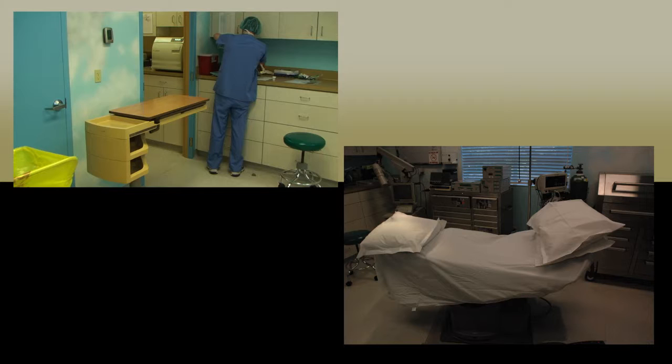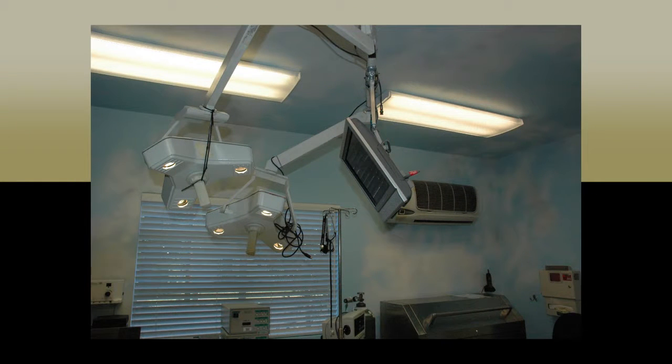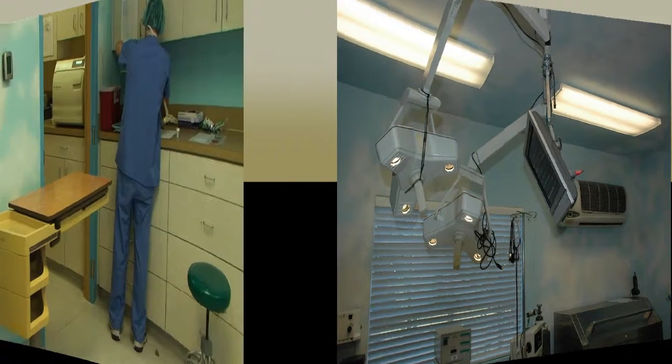These items and the field should be positioned in an open area furthest away from the OR door due to the fact that opening and shutting the door creates air current, stirring up particles and contaminants. All furniture, tables, and stands need to be positioned 12 to 18 inches away from any walls, and all non-sterile furniture and equipment. Understand the main pattern of traffic for you and the surgeon, and ensure all non-sterile items are clear from this path. Be sure to position the OR lights directly over the patient's site of surgery, as well as the surgical area of the table for good visibility.